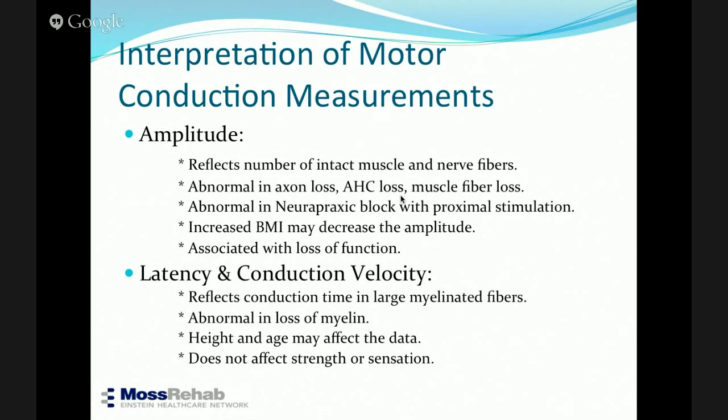So latency and conduction velocity reflect conduction time, again. It's abnormal in loss of myelin. Right? If the myelin is gone, your conduction velocity is going to be slow. Height and age may affect the data. So if you're tall, conduction velocity is going to be slow.